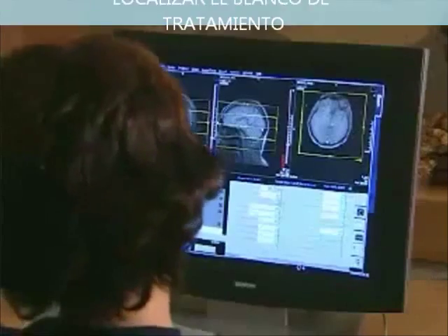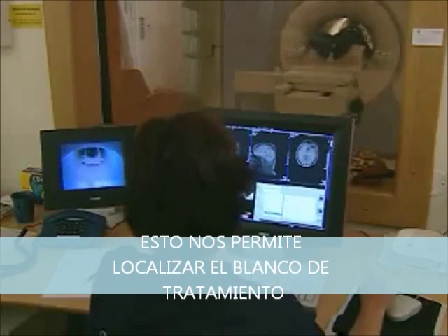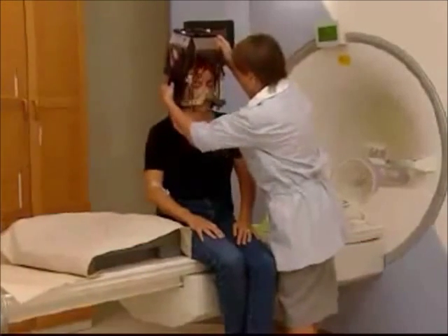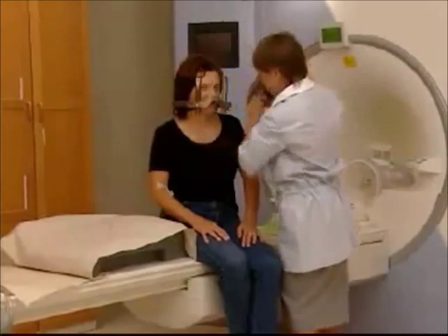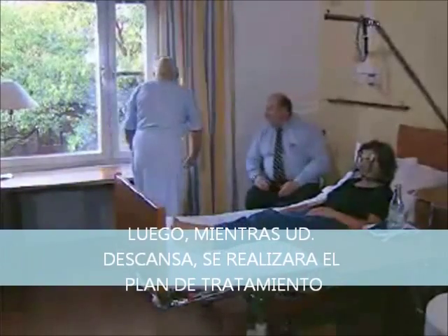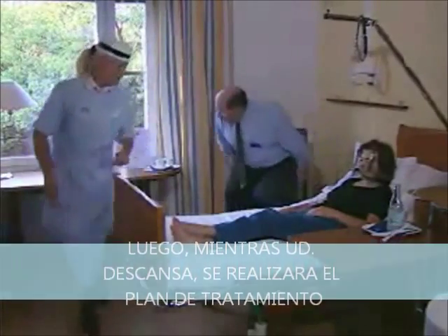The images are transferred to the sophisticated treatment planning computer. After imaging, the coordinate box is removed. Once your images have been recorded, your doctor will develop a treatment plan. Meanwhile, you can rest and do what you want — eat, drink, read, or even watch TV.